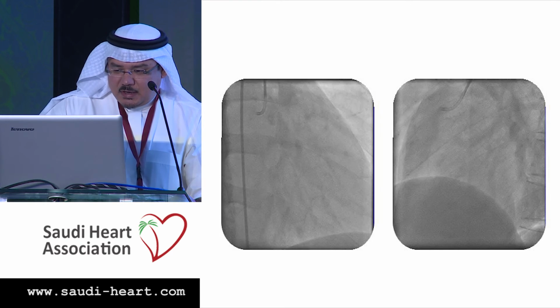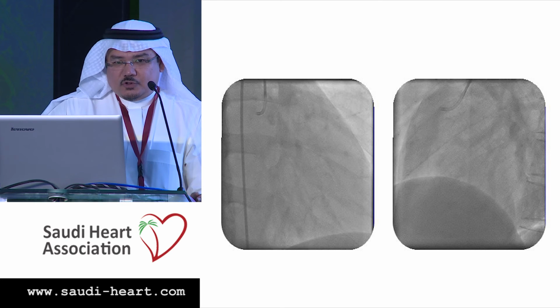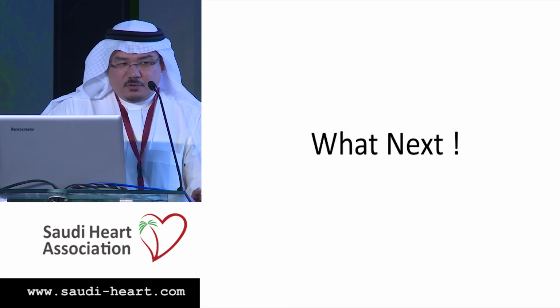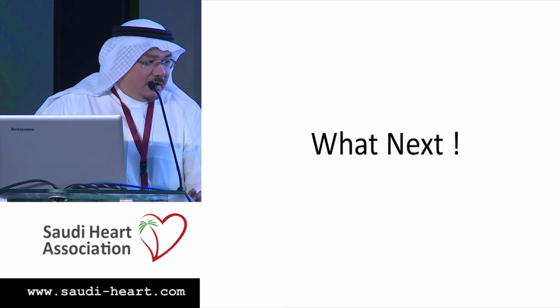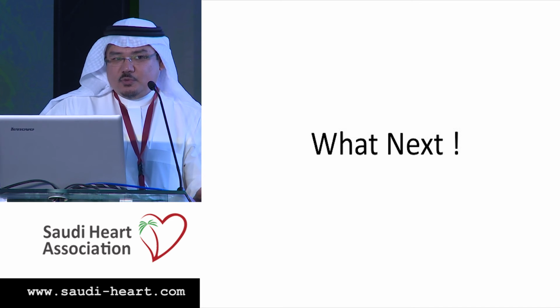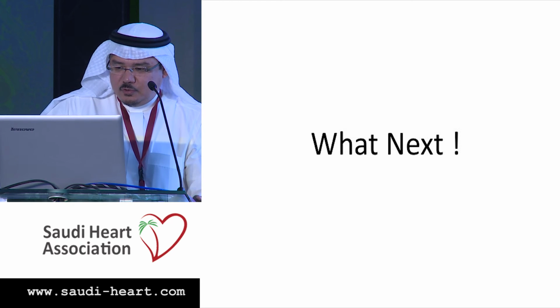The RCA is completely occluded, just before the stent, and there is no distal perfusion. So, should we return him back to the CCU and continue for another 24 or 48 hours of 2B3A blockers? Or should I proceed with a trial of reopening of the occluded RCA?